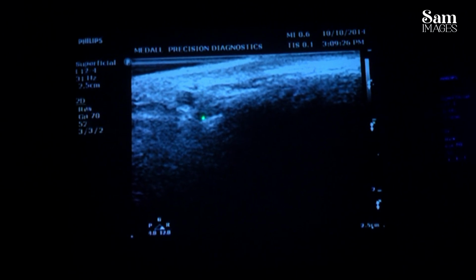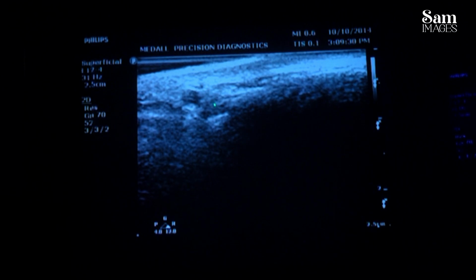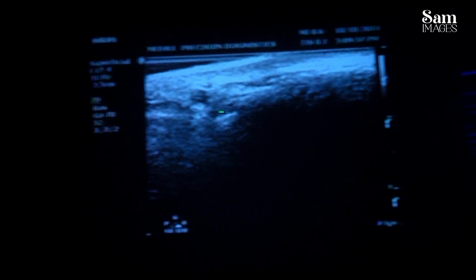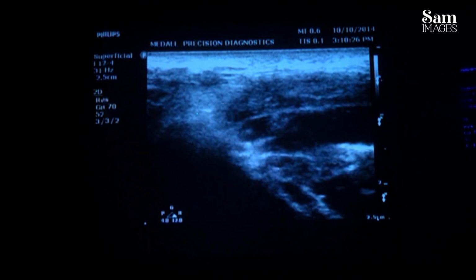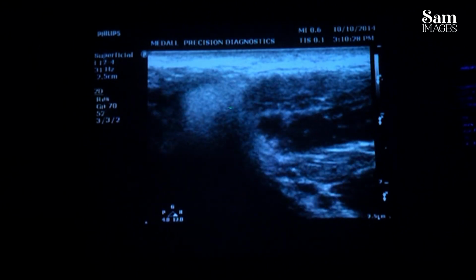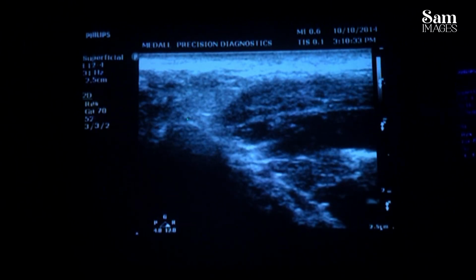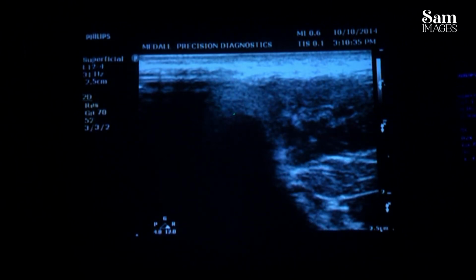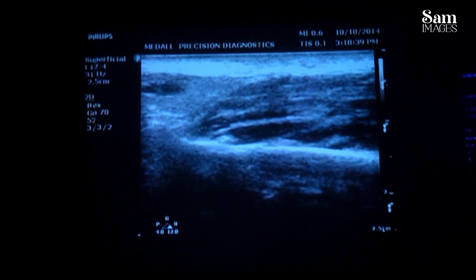See, this is the bone, this is the condyle, and this is the articular disc. So it is normal, homogeneous, with a discoid shape. See, that is the temporomandibular joint. Forward movement is there, and in open mouth and closed mouth you will assess the articular disc, joint spaces and all. This smoothness should be there.